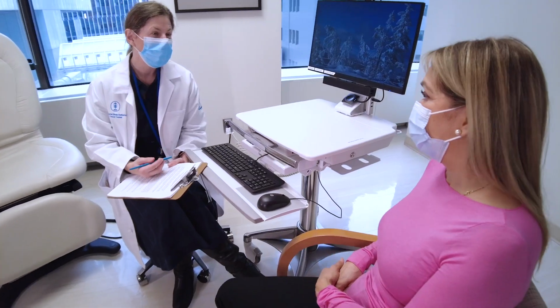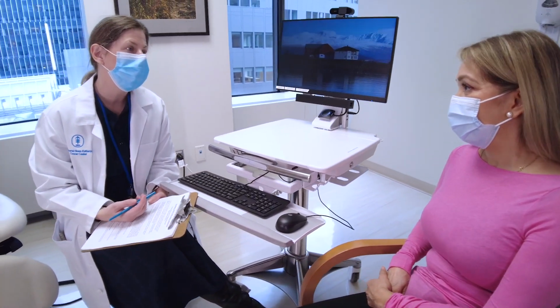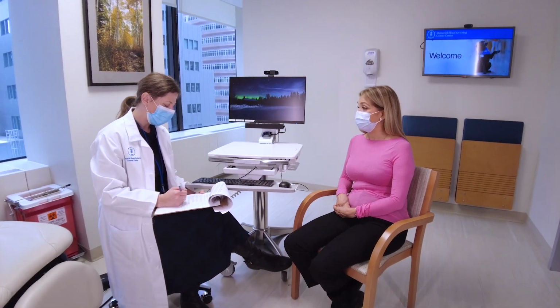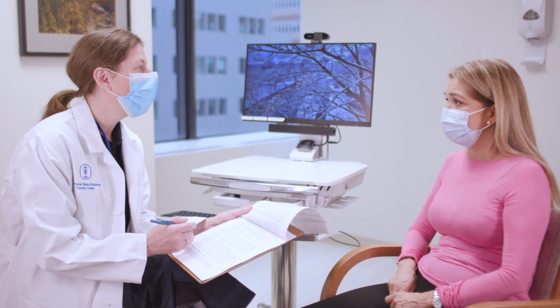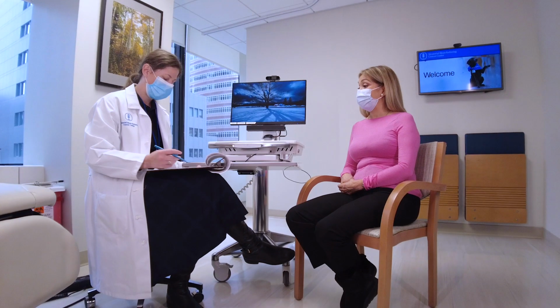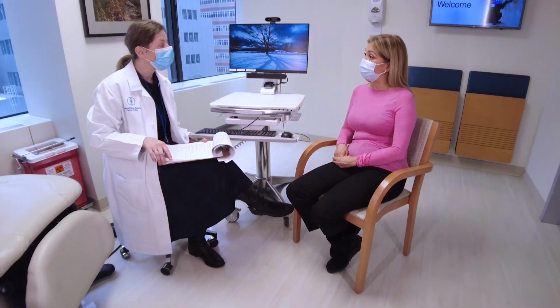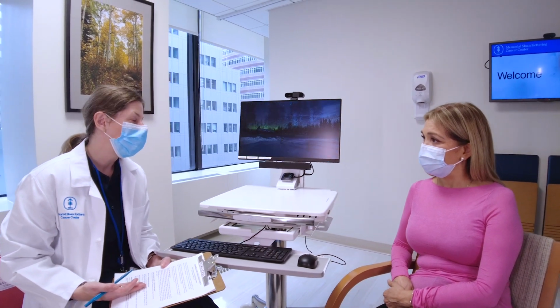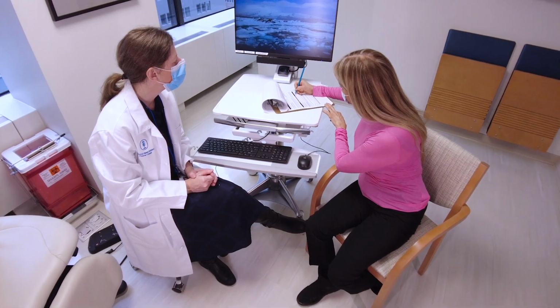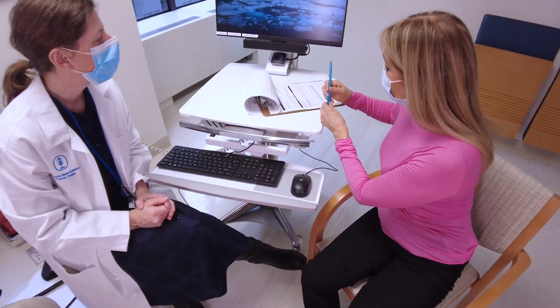The blood collection process begins with patient consent for the collection of their samples for research. The patient arrives at the clinic, where a clinician reviews the consent documents with the patient and answers any questions the patient may have. Once patients provide consent, they are enrolled in the study.